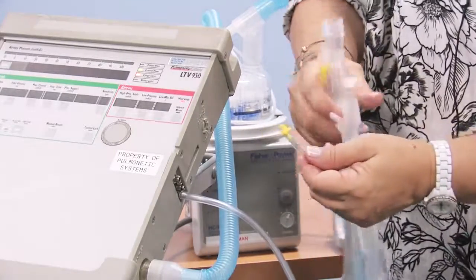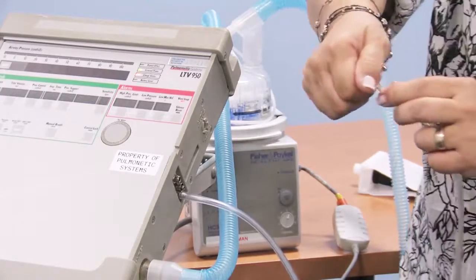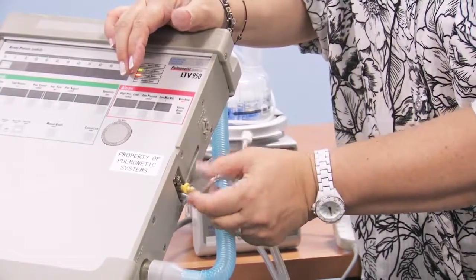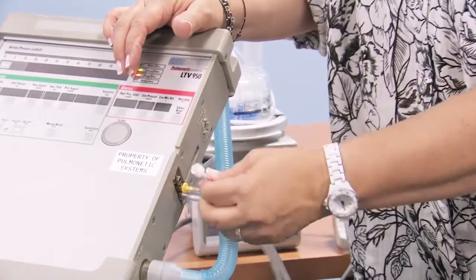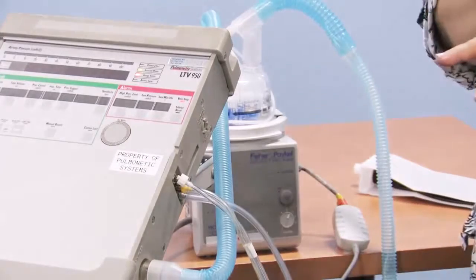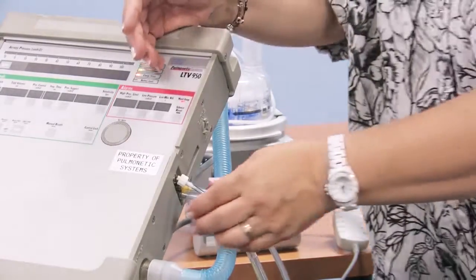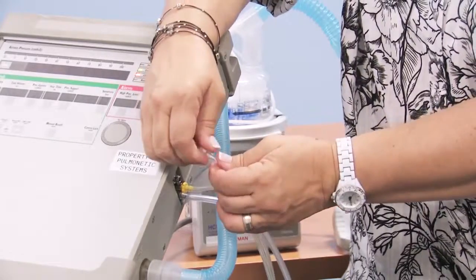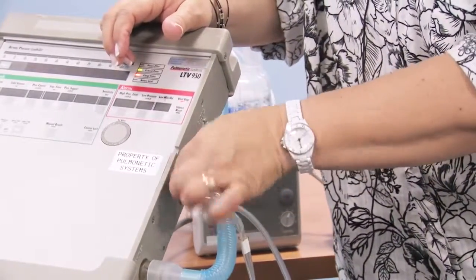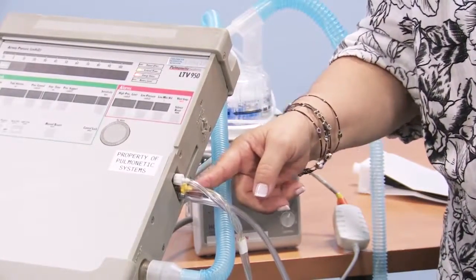What I'm going to ask you to do is turn this rubber plastic hose backwards so that when you try to put it on the machine, it wants to go forward. If you just twist from point 0 forward, it may want to come off. And we don't want alarms in the middle of the night because something came loose and frightened everyone. So let's turn them backwards, counterclockwise, and let them turn themselves on and just give them a tighten. Assure that they're straight on and not crooked.